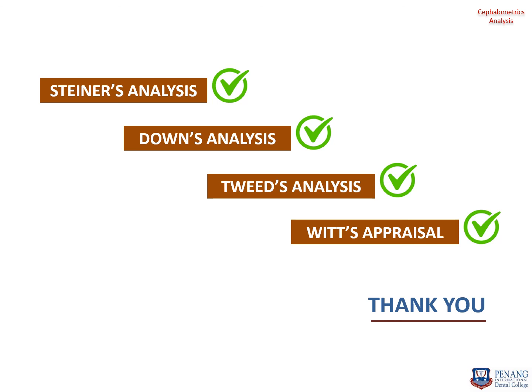Then it was about Tweed's, wherein we understood 3 planes and 3 angles. And finally, we finished with Wits appraisal, wherein you learnt about the A and B angle and why not to use it, how to measure AO and BO, and what the clinical implications of AO and BO are.